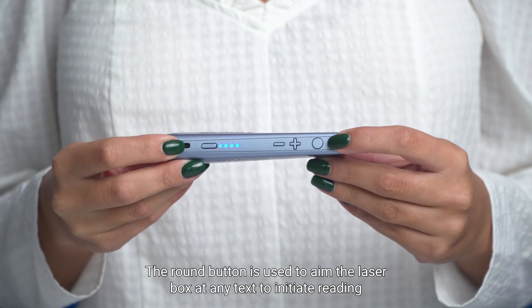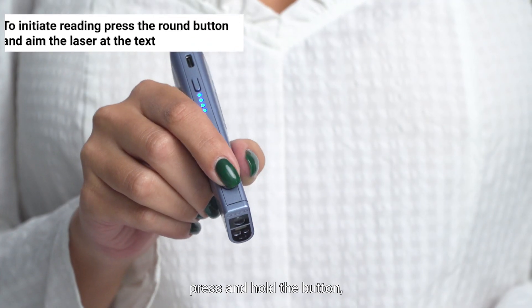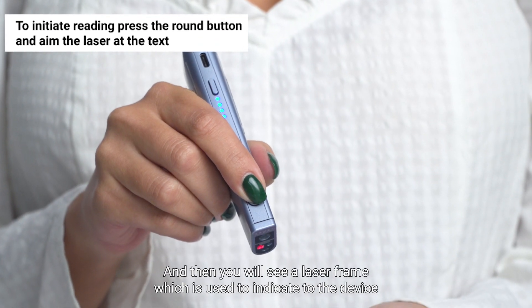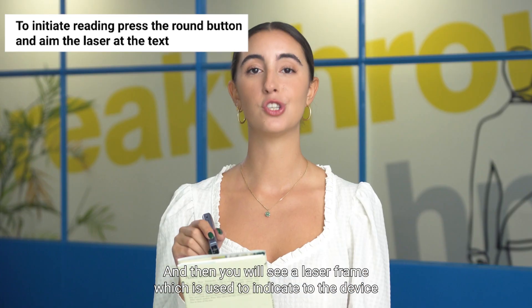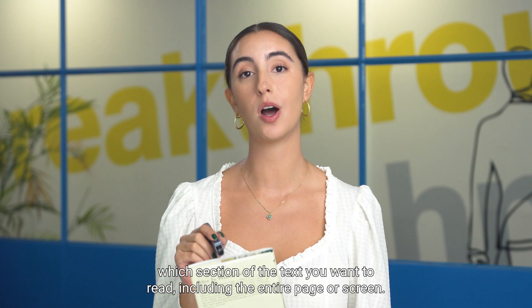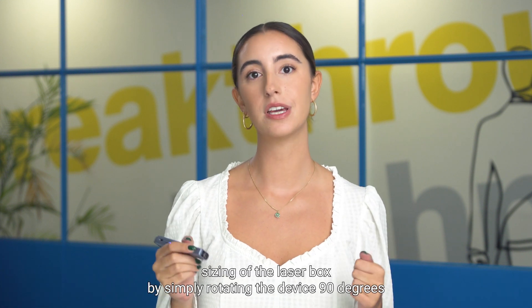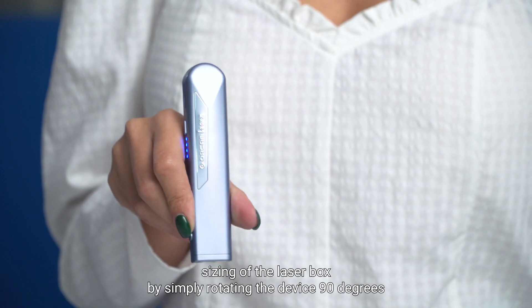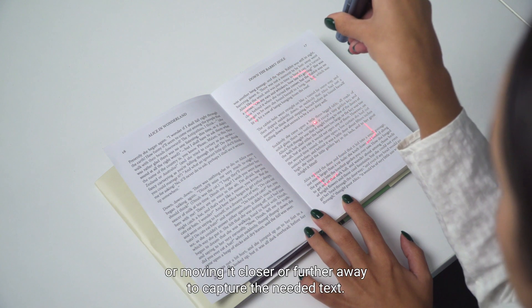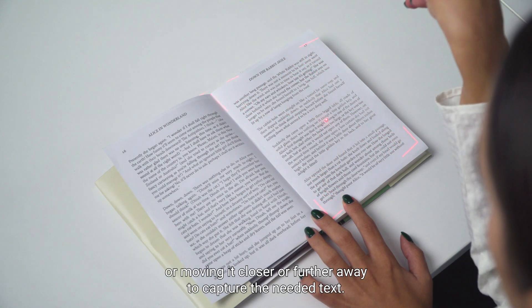The round button is used to aim the laser box at any text. To initiate reading, press and hold the button, and then you will see a laser frame, which is used to indicate to the device which section of the text you want to read, including the entire page or screen. You can also get different sizing of the laser box by simply rotating the device 90 degrees or moving it closer or further away to capture the needed text.